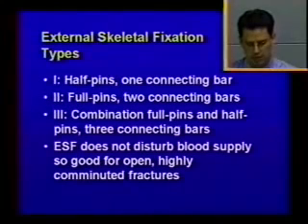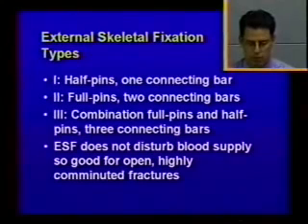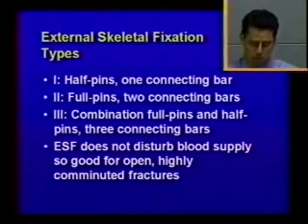The various types of external skeletal fixators are the type 1. Type 1 is going to be comprised of half pins. These are pins going from a connecting bar into the cortical bone, and they penetrate both the near and far cortex of the bone, but they do not exit out the other side of the leg. So there'll be half pins and one connecting bar. Type 2 will be full pin, so the pin's going to go through the skin, through the bone, and out the skin on the other side, and then we'll have a connecting bar on either side of the leg, so there'll be two connecting bars.